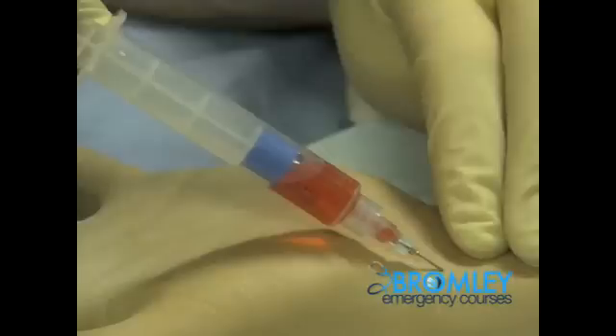It is essential, as with all procedures, to ensure that you introduce yourself, explain the procedure fully, and obtain verbal consent. It is also essential that in all procedures, universal precautions are undertaken. These include gowns, gloves, eye goggles, and hand washing.